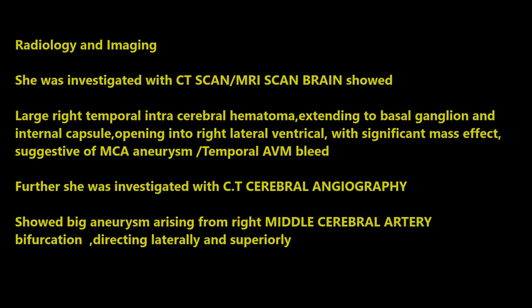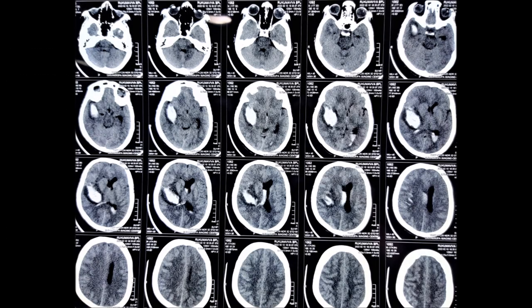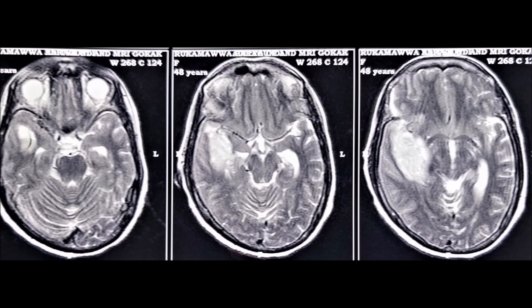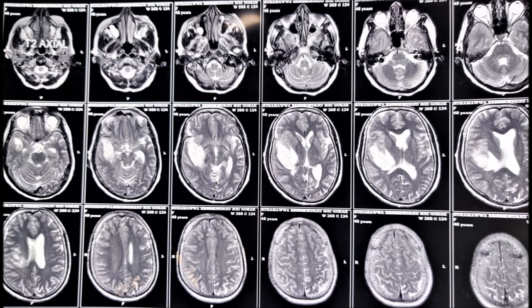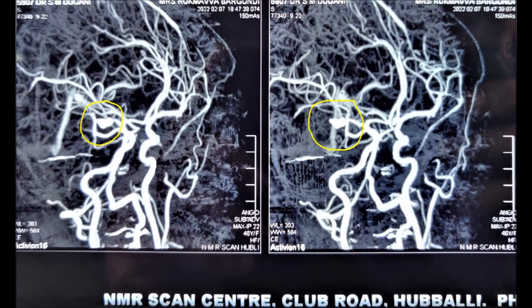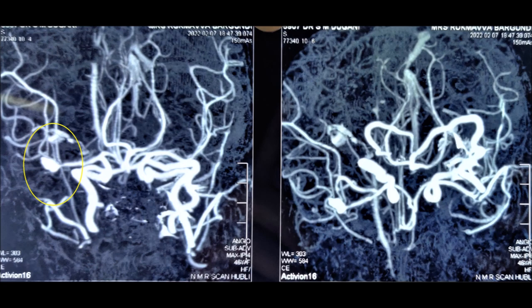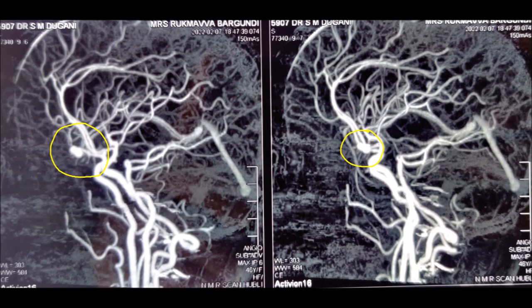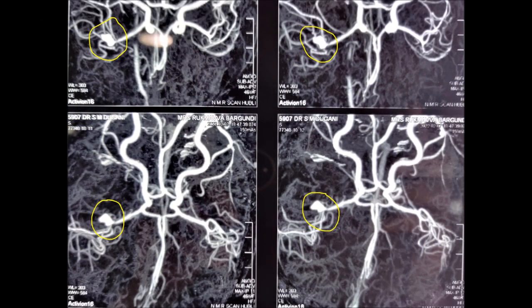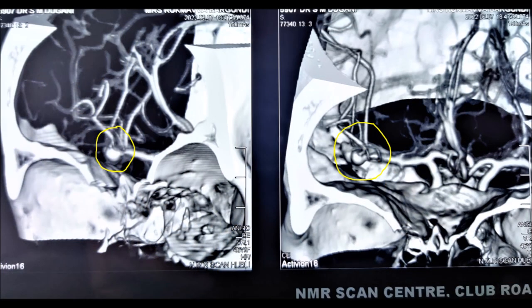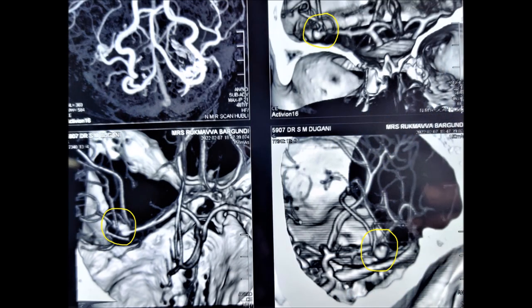She had dense hemiplegia on the left side. CT scan brain and MRI brain showed a large right temporal-parietal deep-seated hematoma extending to the internal capsule and basal ganglia, with intraventricular extension, midline shift, and mass effect. CT angiography showed a large aneurysm originating from the right middle cerebral artery bifurcation, pointing laterally and superiorly, as shown in these angiogram images.